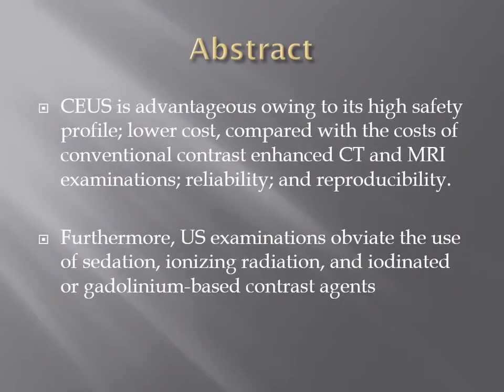So contrast enhanced ultrasound has advantages owing, first of all, to its safety profile, low cost compared to conventional contrast enhanced CT and MRI, and its reliability and reproducibility. Furthermore, the ultrasound examination obviates, meaning prevents, the use of sedation, ionizing radiation, and iodinated or gadolinium-based contrast agents and other side effects.